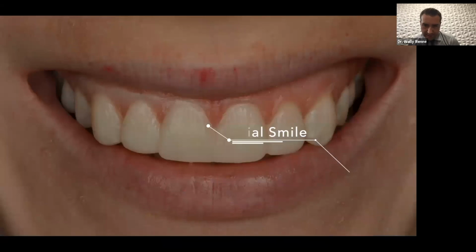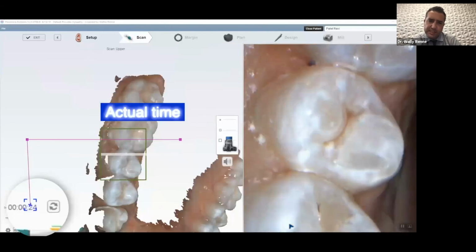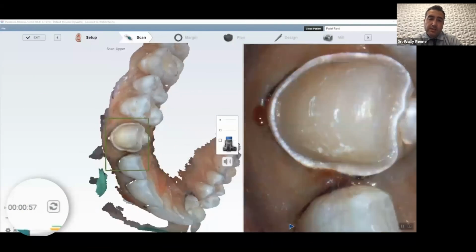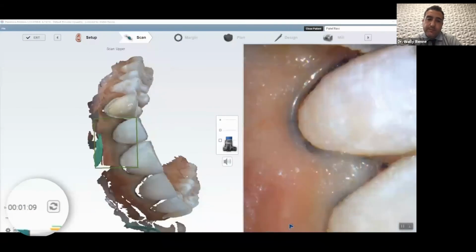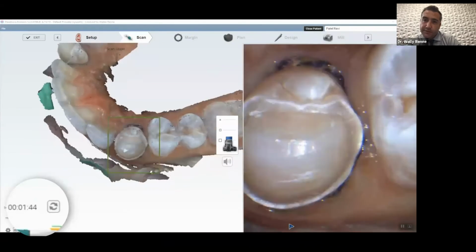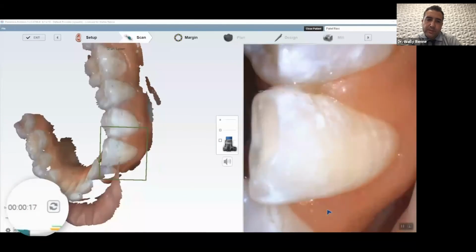Okay, so the patient thinks maybe they're a little bit too bulky here or there, and we might have to do some preps. So here she is on the day of preps. We decided we need to prep the canines. Based off of that additive wax up, based off of the transfer to the smile with the putty wash of the 3D printed model, we knew that we had to bring the cuspids down a little bit more lingual.